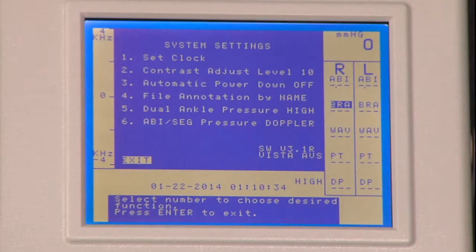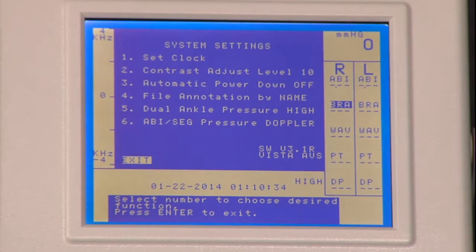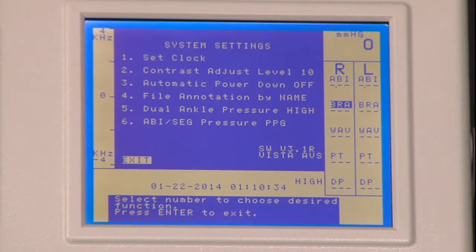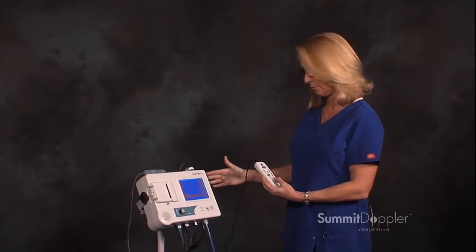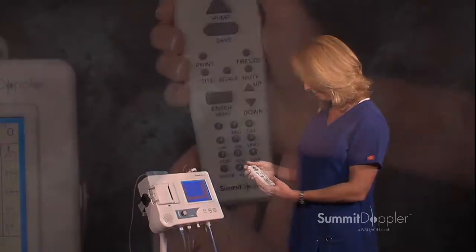Pressing number six for ABI segmental pressure doppler. Pressing number six changes that to PPG. This is telling the unit which modality you'll be using to perform your exam.